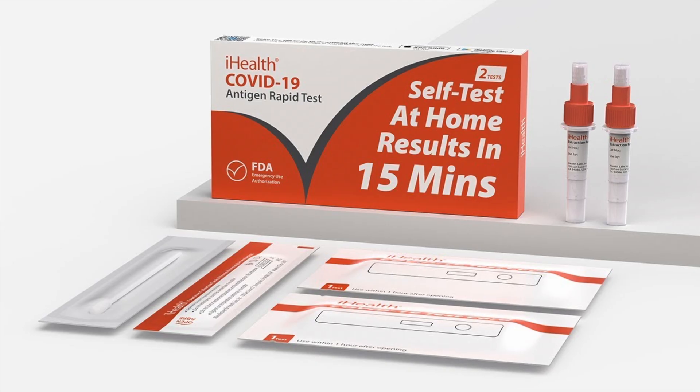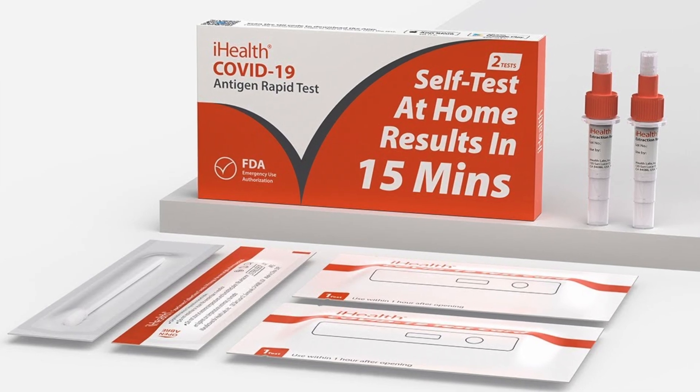Hi, you're probably watching this video because you received one of these iHealth COVID-19 antigen tests from the Boston Public Health Commission. I'm Katherine Hall and today I'm going to walk you through how to use this test.